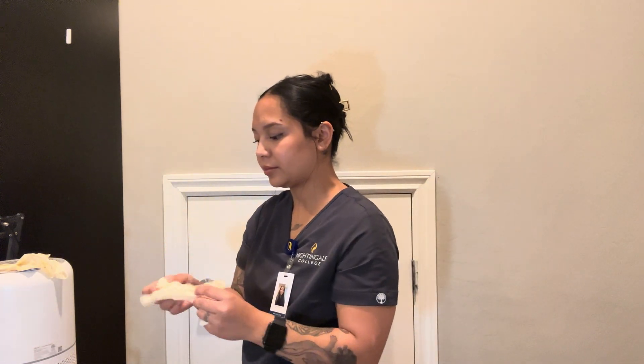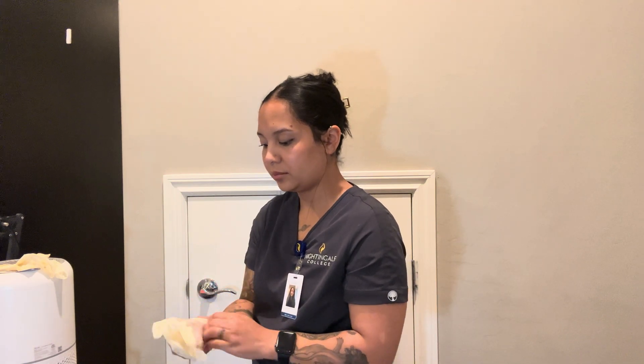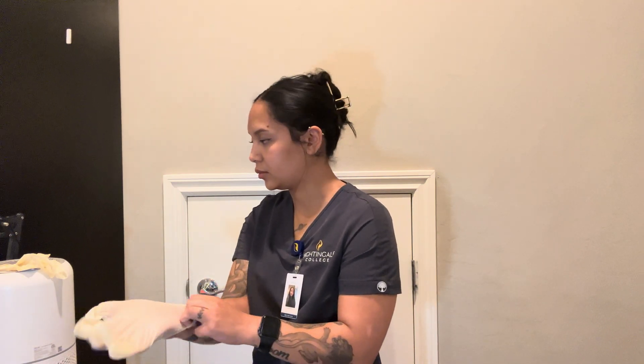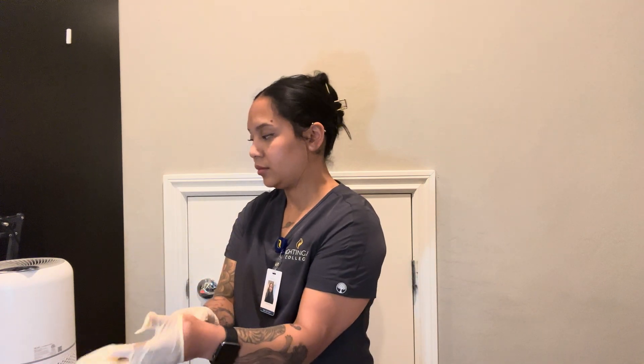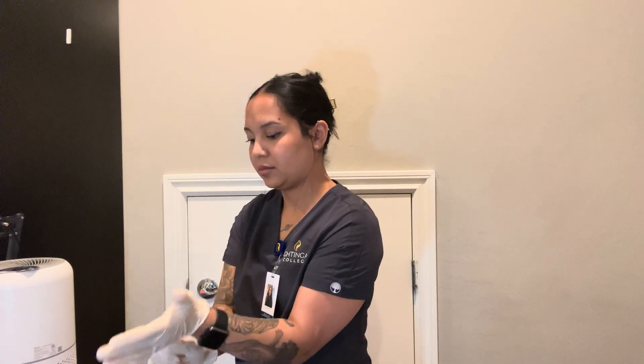Before going into the patient's room, I'm always going to do my hand hygiene, and then don my gloves. I would come into the patient's room, introduce myself, and ask them to verify their name and birthday, which is part of the six rights of medication administration.